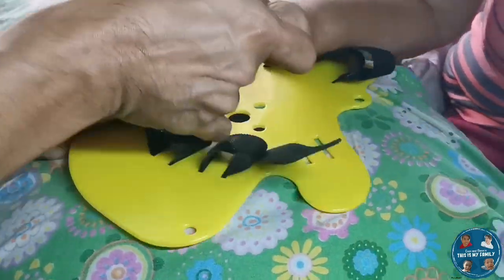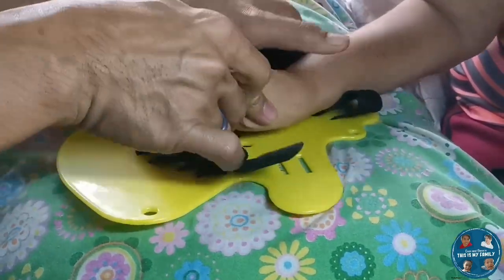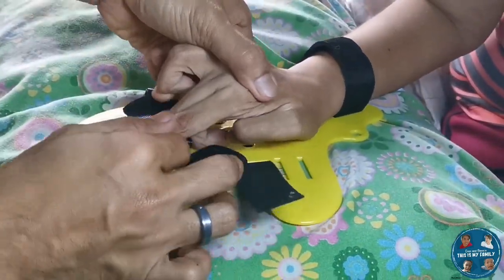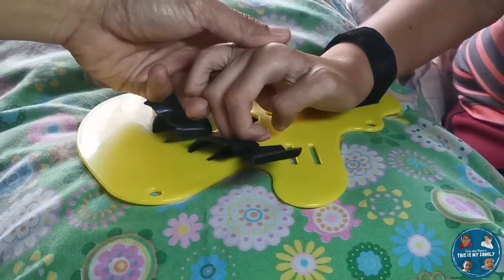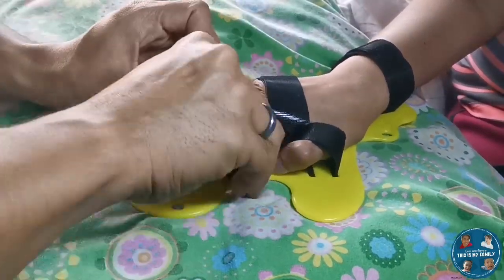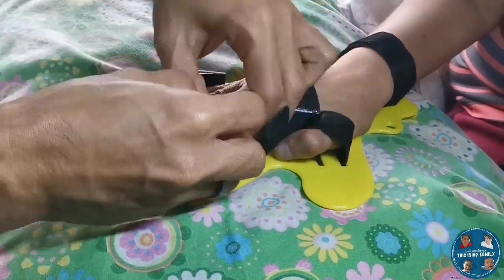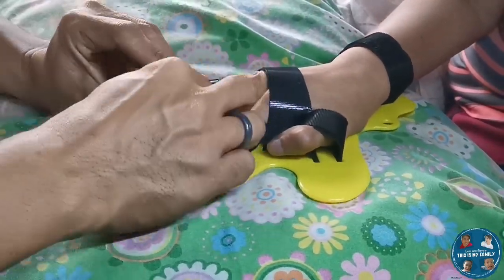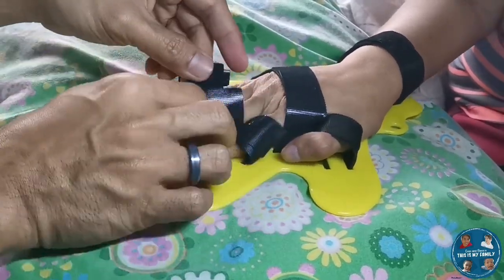The texture of the board is smooth, and the strap is made of velcro, which makes it more secure when you are using it. As you can see, we are trying it out on a stroke patient — let's observe how to use this item.